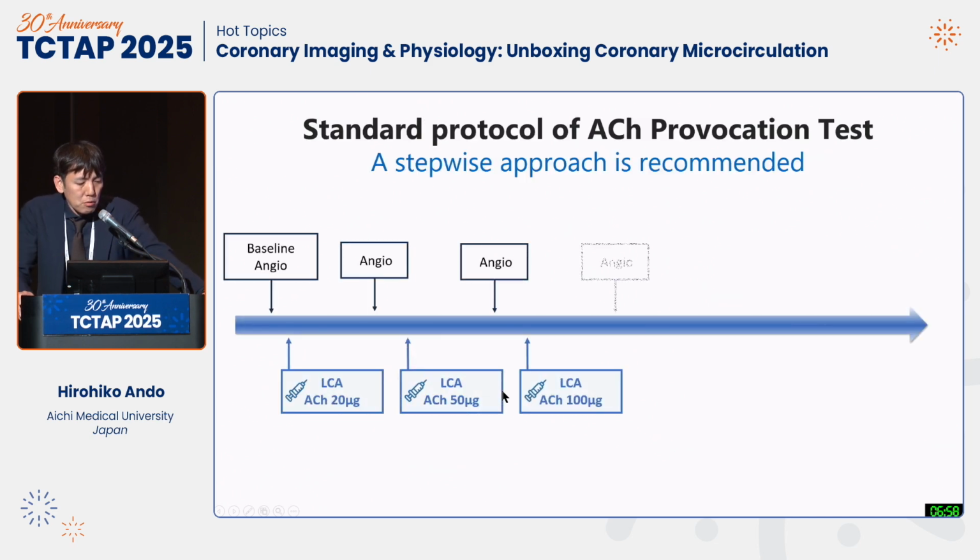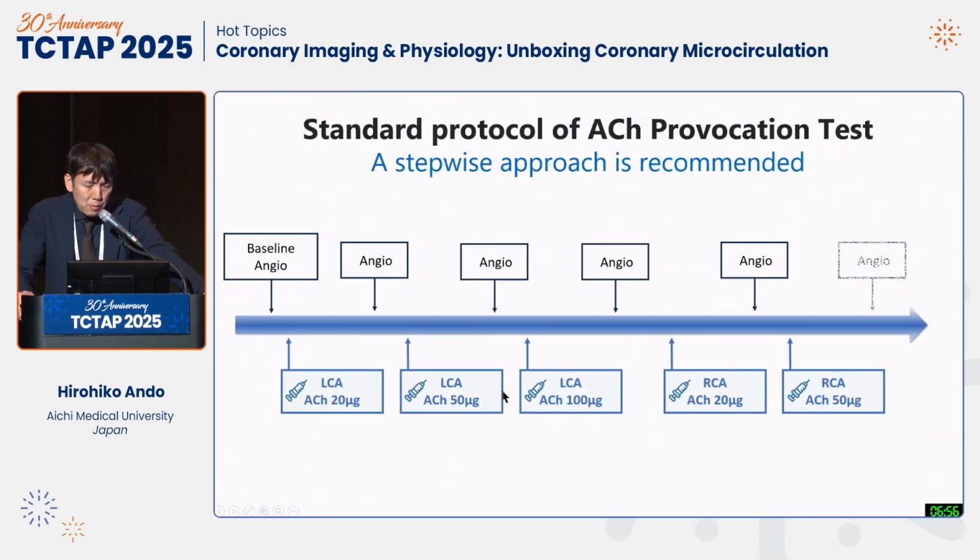This slide shows a standard protocol of provocation testing provided by the Japanese guidelines. As you can see, there are so many steps and it feels time-consuming. But recent studies suggest that some steps can be safely omitted.